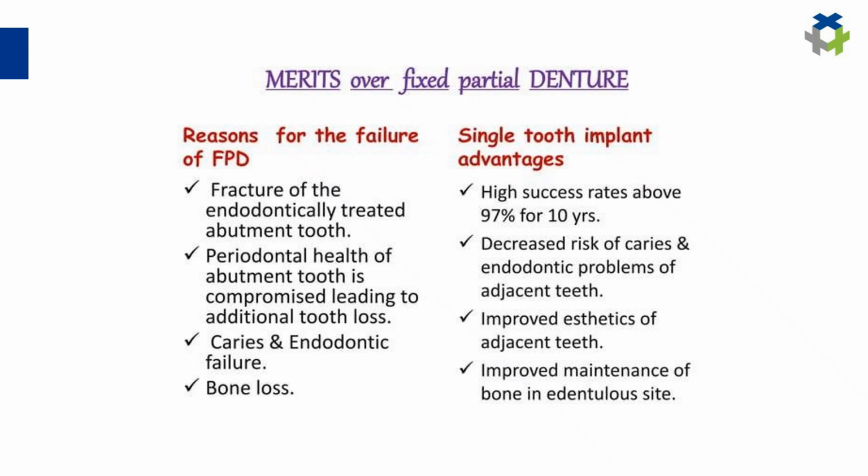What are the advantages of a single tooth implant over an FPD? High success rate, above 97% for 10 years. Decreased risk of caries and endodontic problems of adjacent teeth. Improved aesthetics of adjacent teeth. Improved maintenance of bone at the edentulous site.